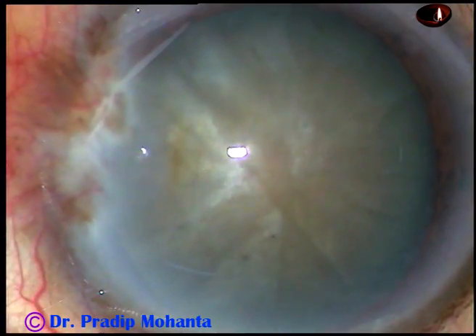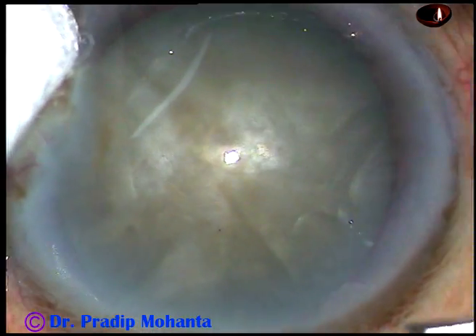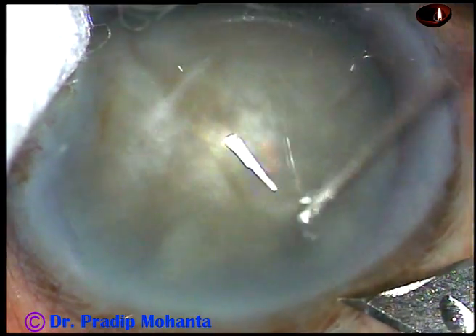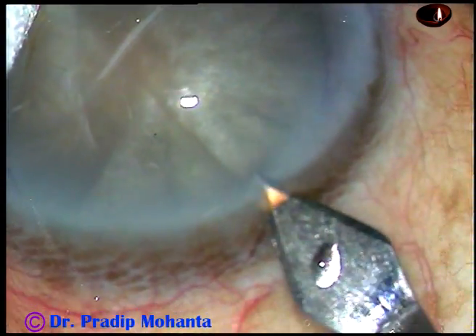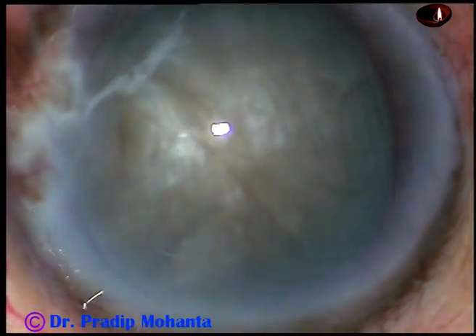The ocular surface is thoroughly irrigated by balanced salt solution and povidone iodine. Then the main incision is placed at a selected site with a 2.8mm keratome. This is a mid-limbal incision.